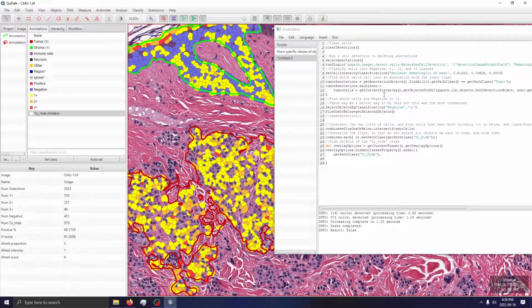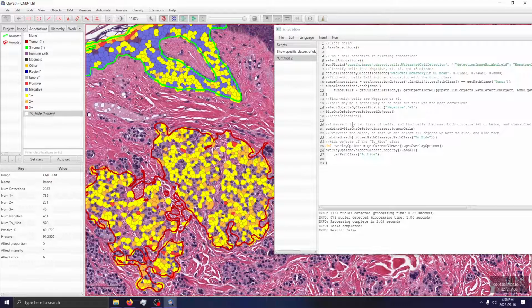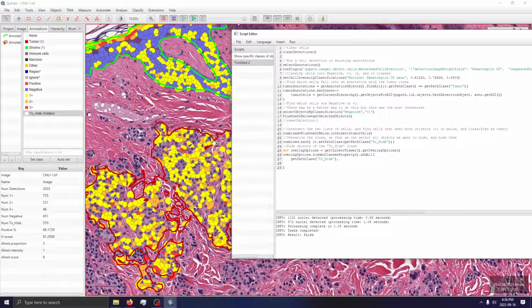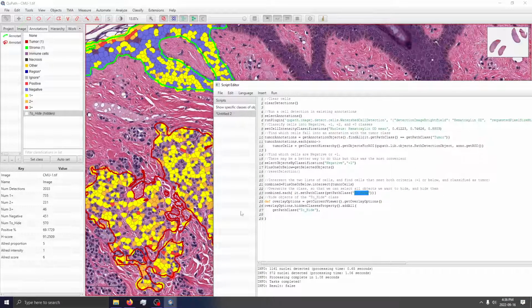There we go. So, sorry about the confusion. I'm not entirely sure what went wrong. But as you can see, we've hidden any cell with the classification toHide. So let me just summarize what happened since my initial idea of going line by line didn't really work out when I wanted to demonstrate this.